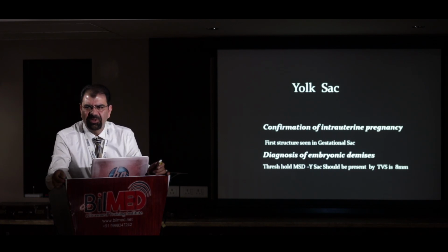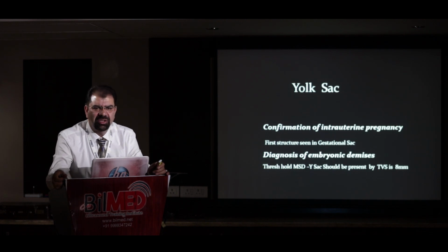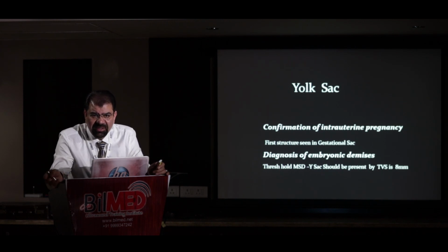It can be transmitted pulsations from the uterine artery. I am not sure whether I am seeing true fetal pulsations or transmitted pulsations from the maternal side. Why not go to the tiffin and see whether the tiffin is normal, and if the tiffin is not at all there, how is the baby surviving then?